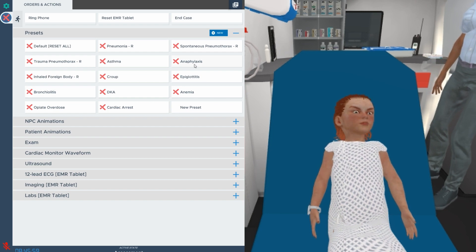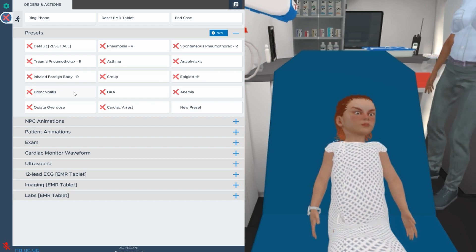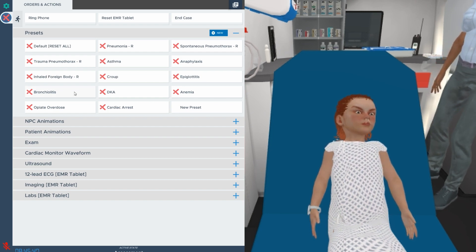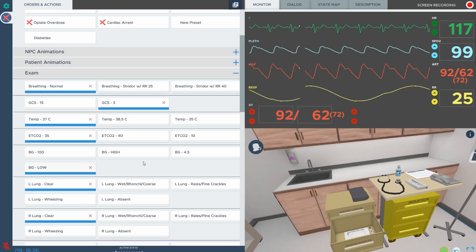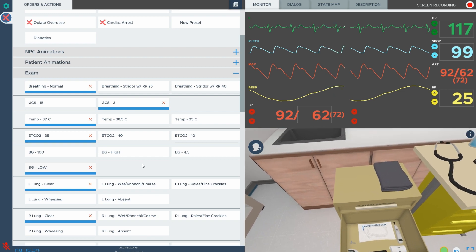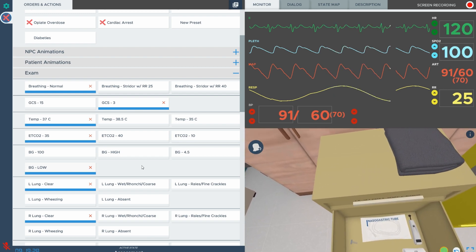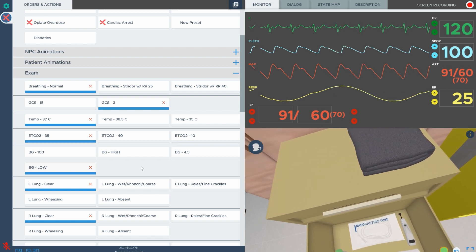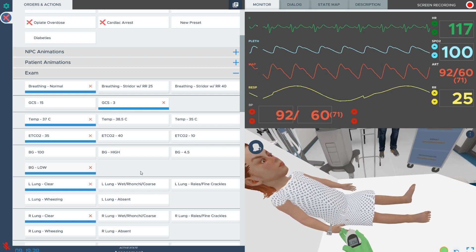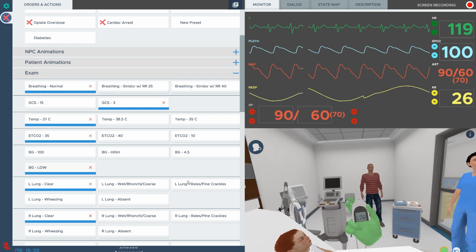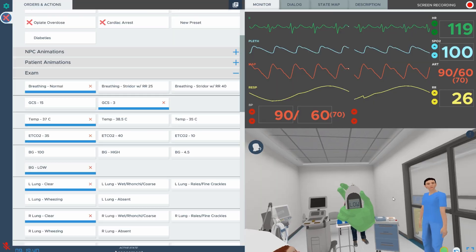And the best part? You can save your selections as your own customized preset. Build it once and use it every time you log in. Dynamic adjustments to patient vitals are reflected in real time.